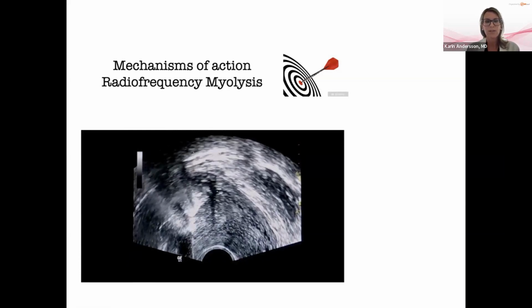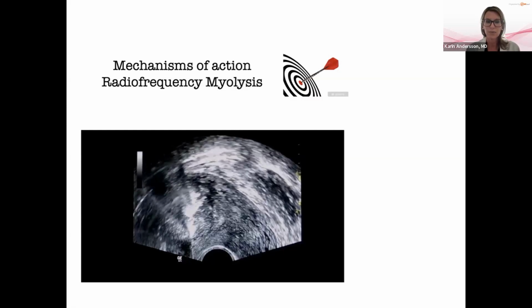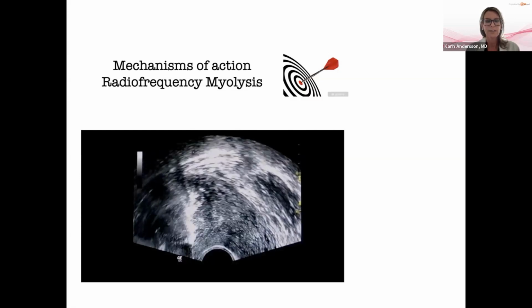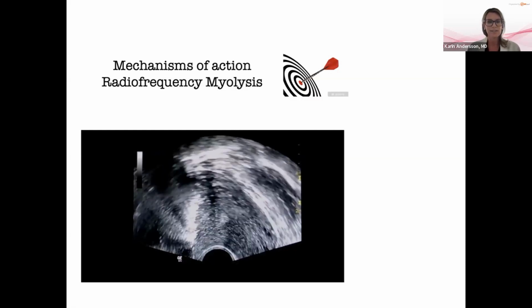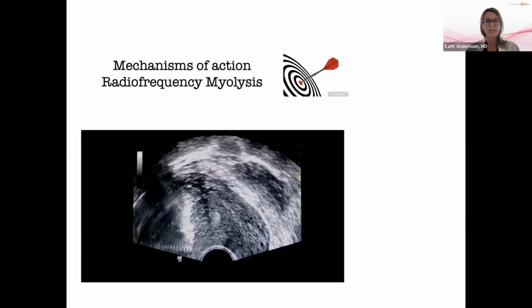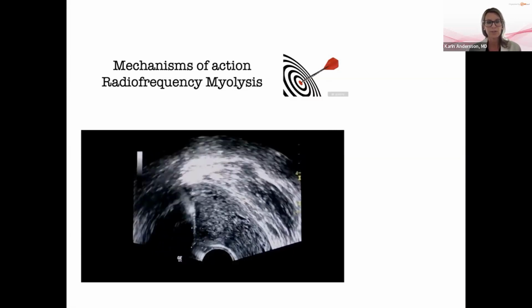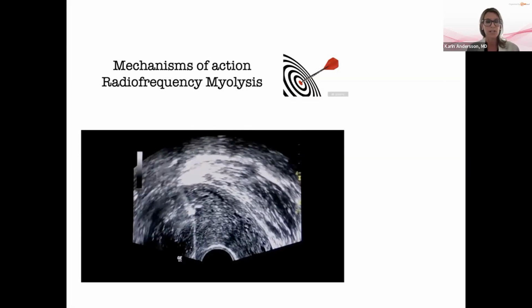And when the impedance gets higher, you move slowly. You can take out the electrode slowly, like you see here. And the slice of the fibroid is actually made at this point. Okay, then you move around. It's a sphere, so you move around. Depends upon which electrode you choose.